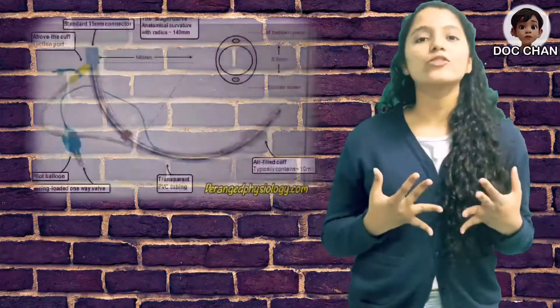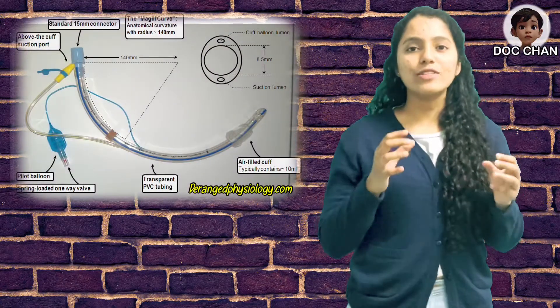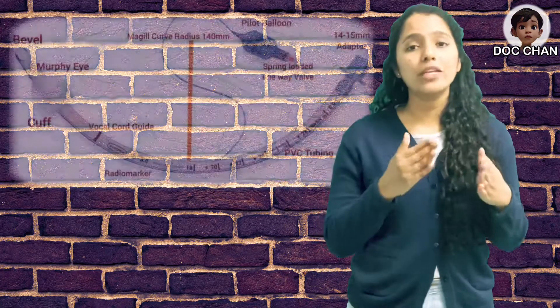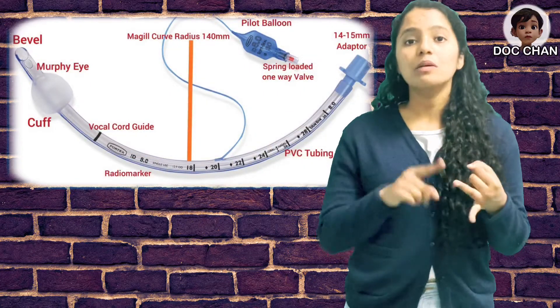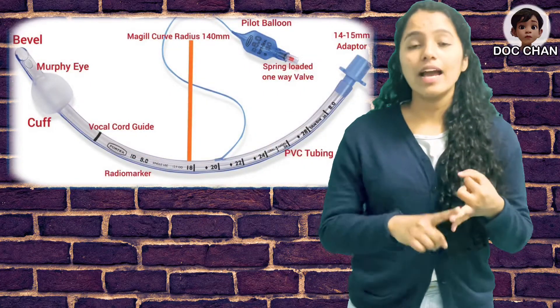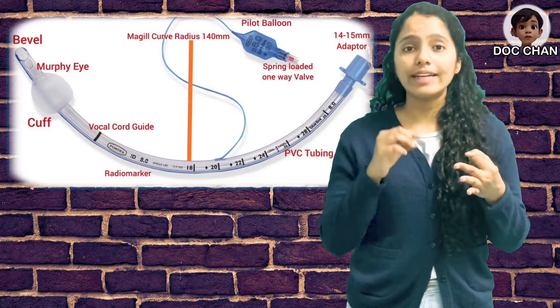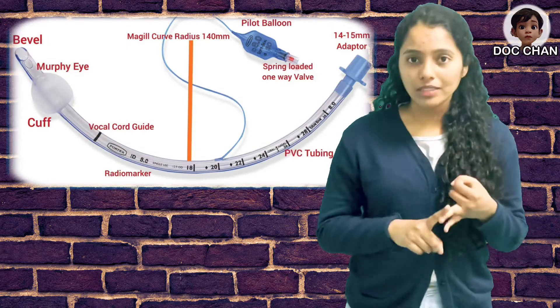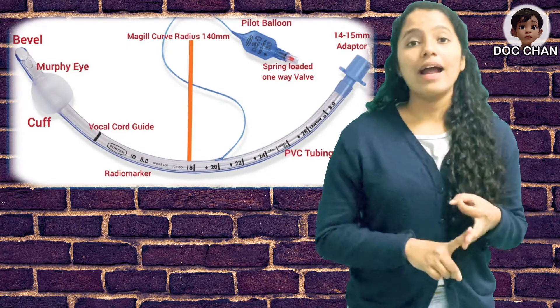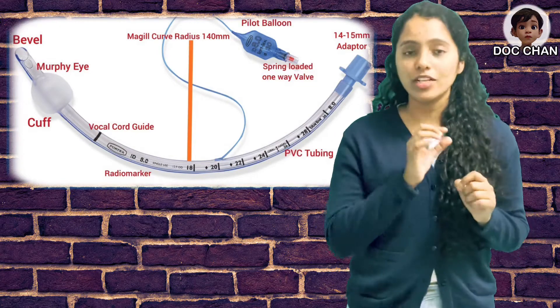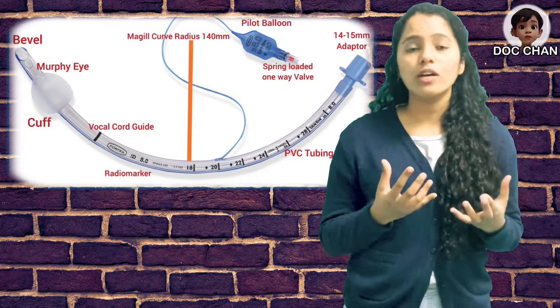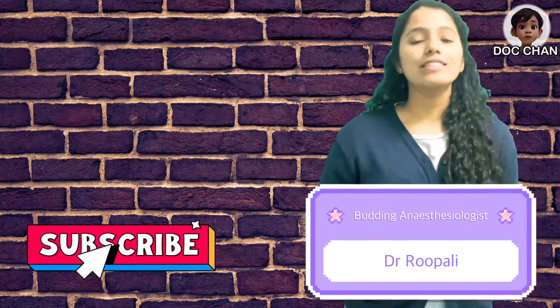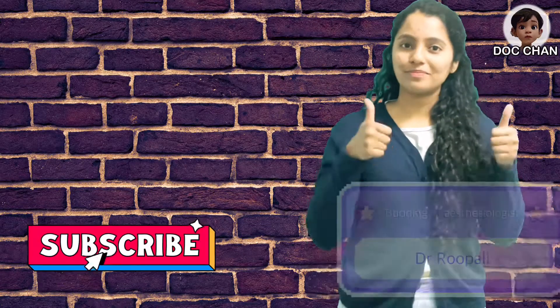To summarize: the endotracheal tube used for intubation has a ventilator end and a patient end. At the patient end, we have a bevel, Murphy's eye, and a marking used as a guide to know the depth of insertion. It has different markings, areas of curvature, and it's made of a transparent material which helps us know if there is any secretion in the lumen. All the best for your intubation.